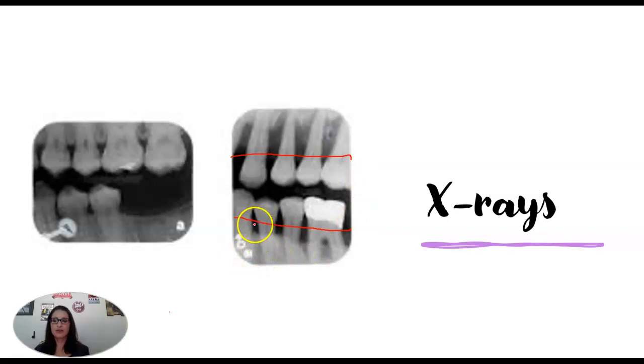And so you can see that there is significant bone loss, especially more so in some areas than others. So that's why vertical bite wings in this case are going to be important. We can see, like I mentioned, along the canine it's pretty steady across. Once we start getting into the second premolar here, the bone level starts to drop and recede a little bit more as we get along to our molar area.